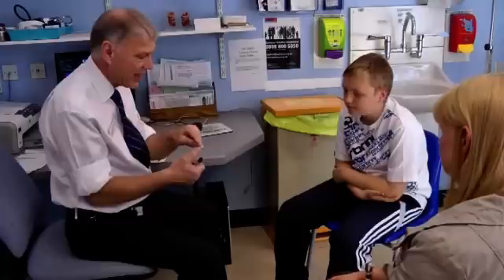What have I done? I've injected my own thumb. Now that's really serious — that's very bad news, because adrenaline injected into the end of the thumb will really switch off the blood supply, and there's a risk the end of the thumb could actually die. So be very careful about this.